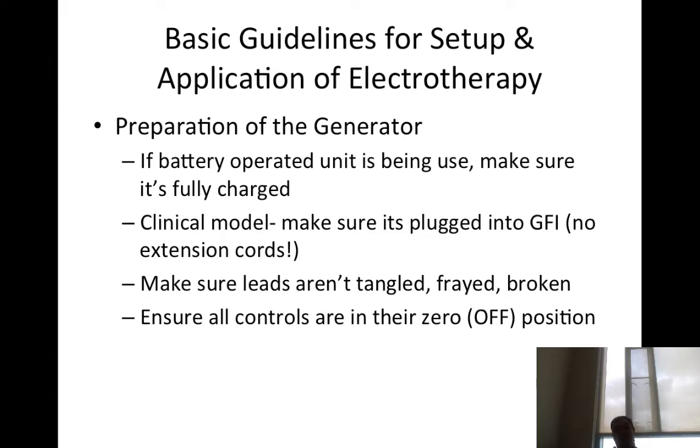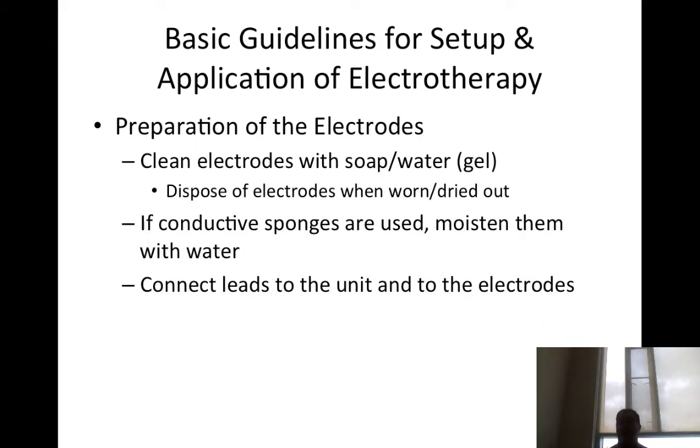This will shut off electricity to the patient, to the generator, so the patient doesn't get electrocuted or burned. No extension cords, because that's a fire hazard. And make sure the leads aren't tangled, frayed, or broken. And ensure all buttons are at zero or in their off position.